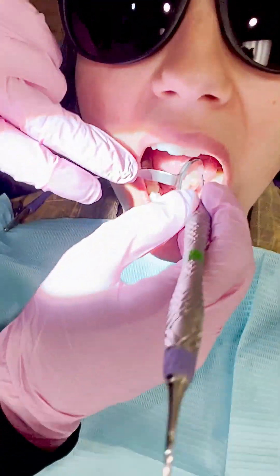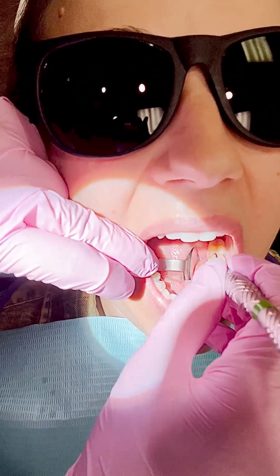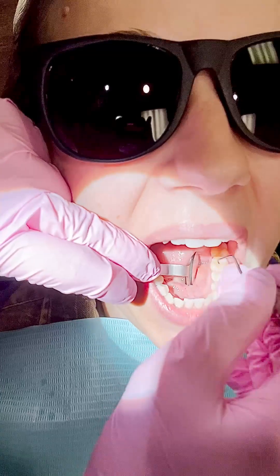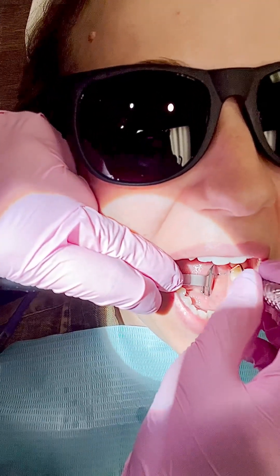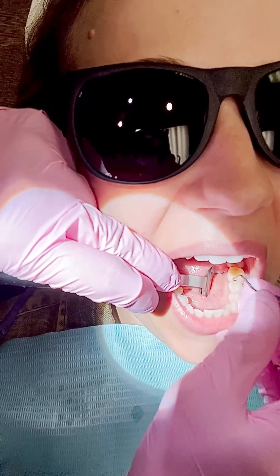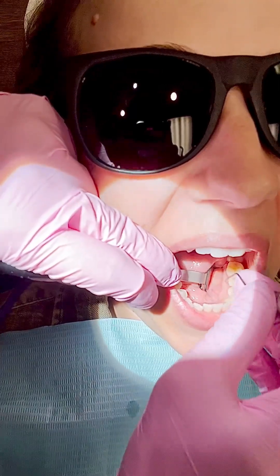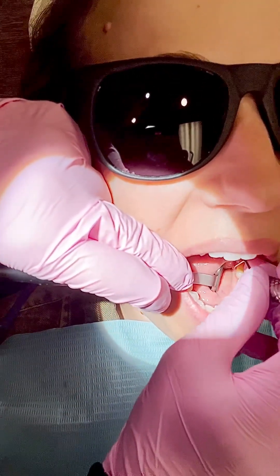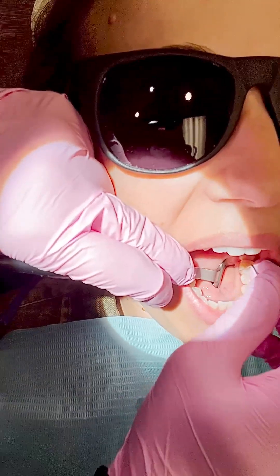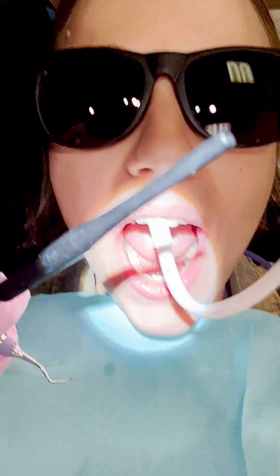I let the patient close and take a second to breathe. I try not to powerhouse through the whole thing. I'm fulcruming on the premolars here. I have very long fingers and big hands — I wear a medium to large glove — so I do a lot of extra-oral fulcruming. You can see I'm retracting her tongue out of the way with the mirror.